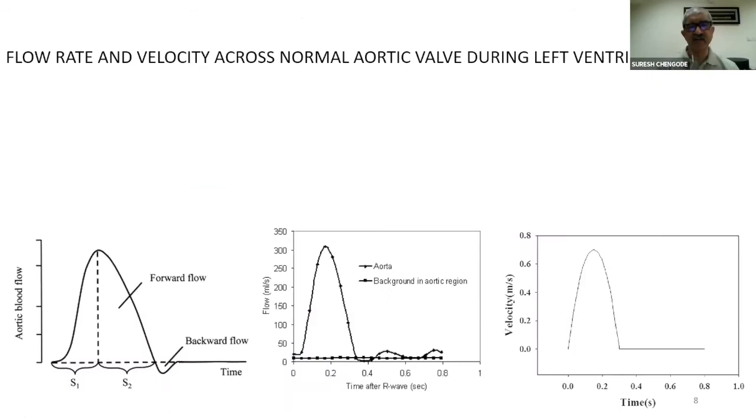Another aspect is that the flow is never continuous. The flow is pulsatile, or phasic. So either during systole or diastole, the velocity increases, reaches a peak, and then comes back to the zero or base level.